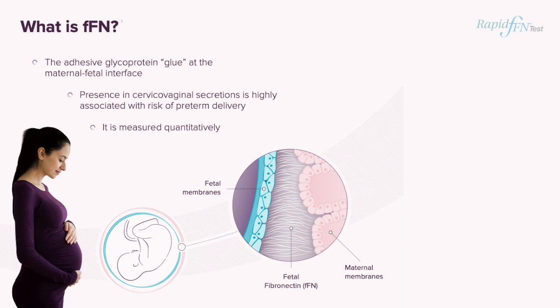Qualitative tests only issue a positive or negative result. All qualitative tests based on a single threshold are prone to increasing false positive or negative results around the threshold. As you know, we can now measure fetal fibronectin quantitatively, addressing the limitations of a qualitative style test.